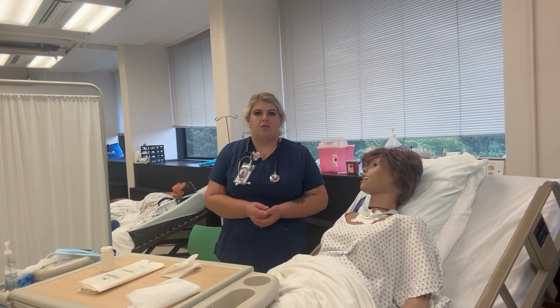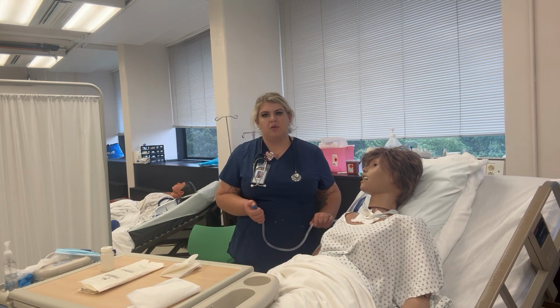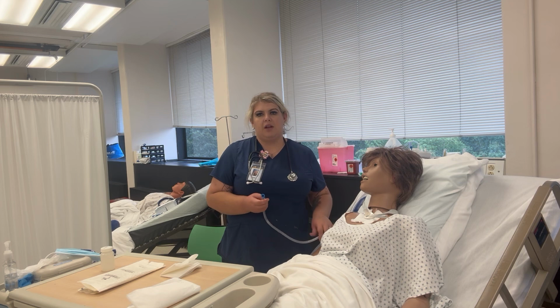So we are going to go ahead and proceed with tracheostomy suctioning. Before we start any kind of procedure with suctioning, we always want to test the suctioning, make sure that it is working before applying the catheter. When we are doing suctioning on adults, we don't want to exceed more than 150. 125 for children and 100 for newborns.